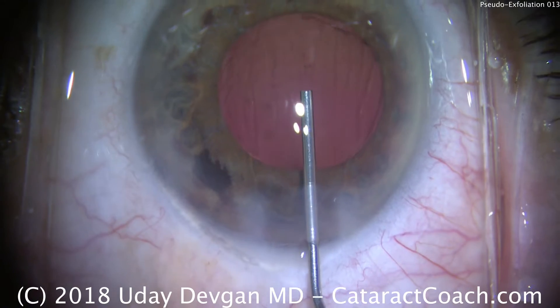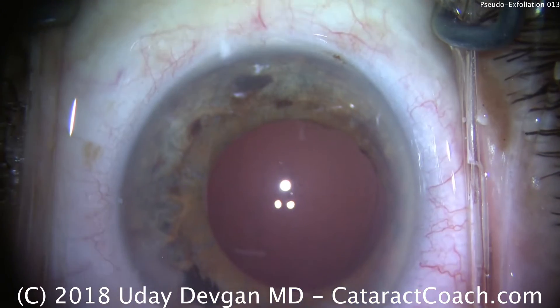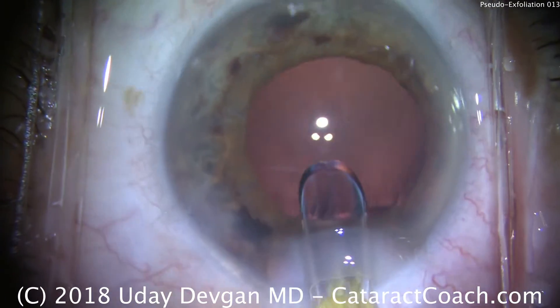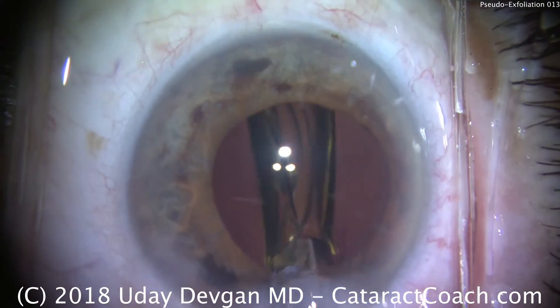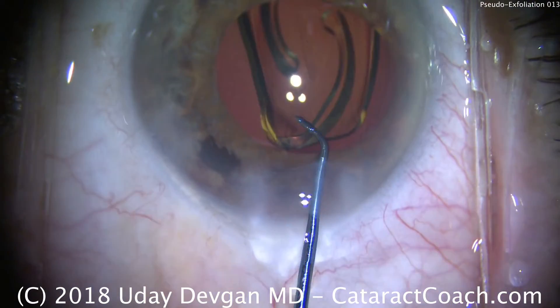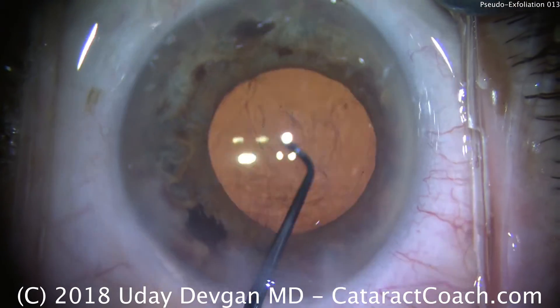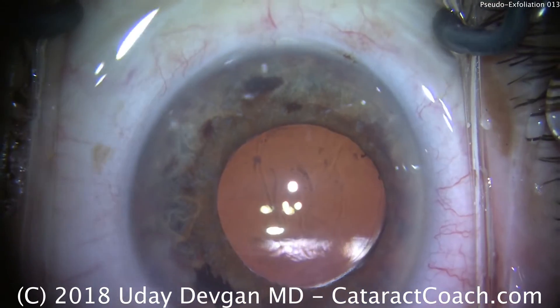Filling our bag with viscoelastic — now we're using a cohesive viscoelastic. We expand the pupil a little bit more; you can see the edge of the capsulorhexis. An IOL is being implanted inside the eye. You can use a three-piece lens here. Some people, if the zonules are bad, will place the haptics in the sulcus with optic capture. A one-piece lens is also perfectly fine, especially in this case where the zonules appear to be pretty reasonable during surgery. For some patients with pseudoexfoliation, there can be a late dislocation of the entire bag and IOL complex, and that can be sutured back into position.